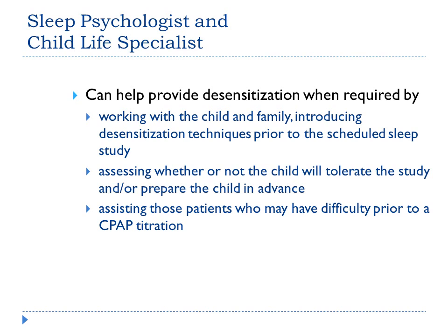The sleep psychologist or child life specialist can help provide desensitization when required, maybe working with the child and family and introducing desensitization techniques prior to the scheduled sleep study. They can assess whether or not the child will tolerate the sleep study. They can also help prepare the child in advance. And they are very good at assisting those patients who may have difficulty prior to a CPAP titration. So our sleep techs are awesome and can do a lot of things. Sometimes you just need to seek help from some of the child specialists to help them with that. Let's go on to our next slide.